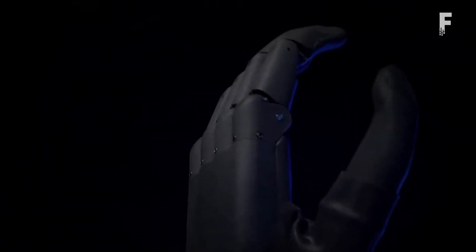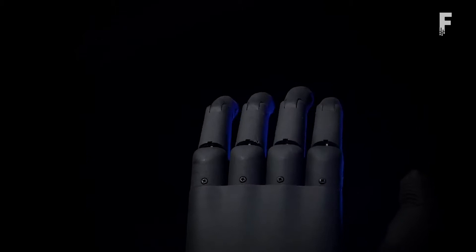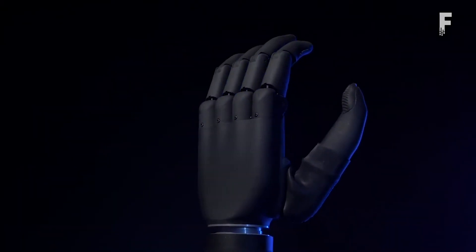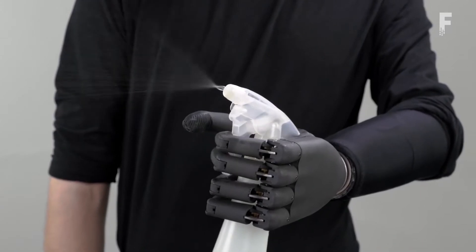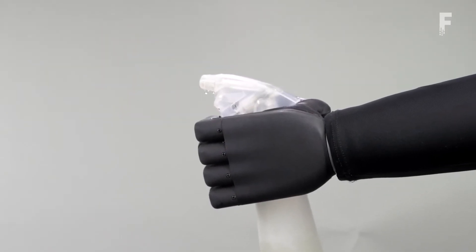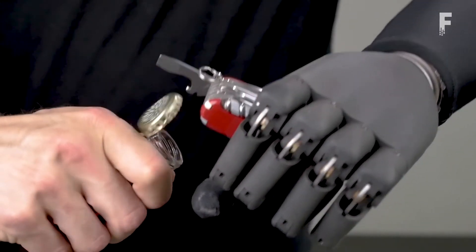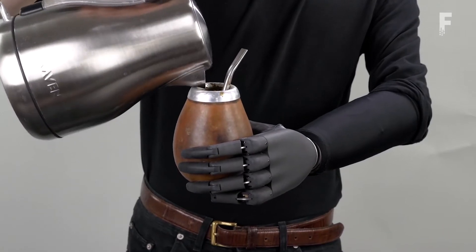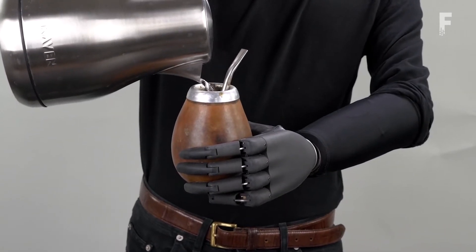Zeus is a multi-action bionic limb combining ease of control with elegant, robust design. The fingers and thumb provide a firm grasp to perform everyday tasks with ease. Individual stalling of the fingers allows for conforming to the shape of the object to pick up objects with varied shape and size. Users can choose from 12 grip modes with an added option of customizing 2 grip modes. Zeus can be used without any additional cover or with a silicone glove.